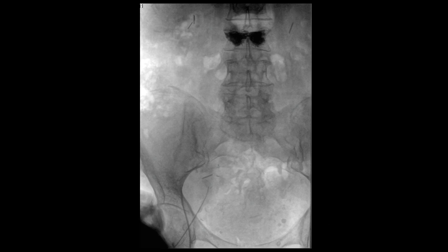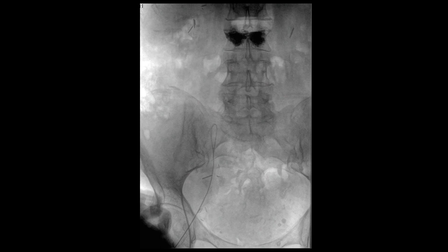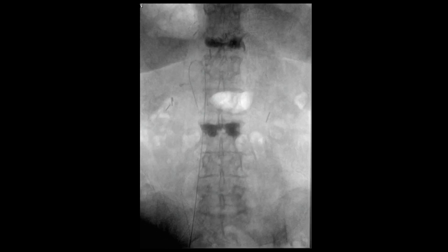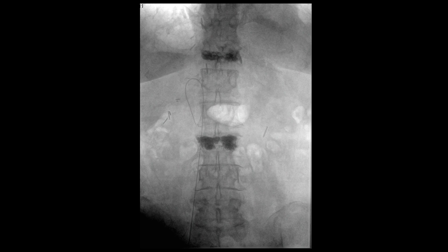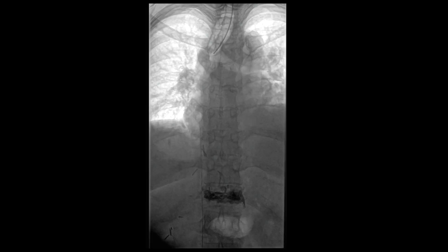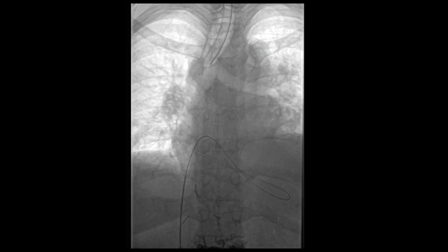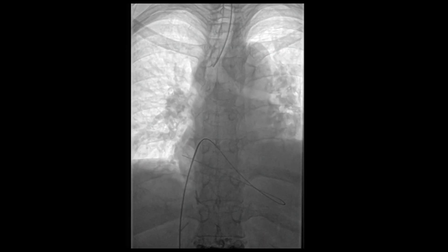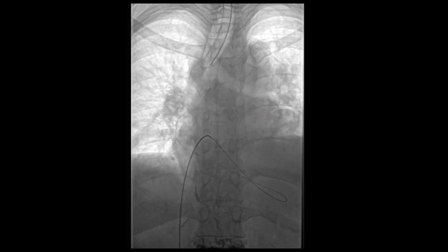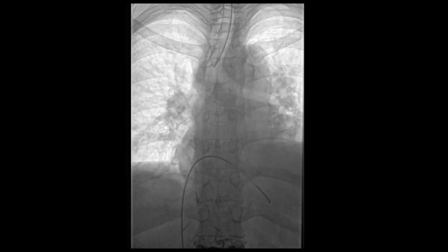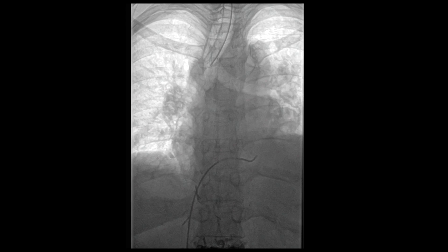Under ultrasound guidance the right common femoral vein was accessed with a mini-stick needle, followed by the wire and micropuncture sheath. We then introduced a Benson wire into the inferior vena cava, followed by advancement of this wire into the main pulmonary artery. This was done with the help of a guiding catheter such as a Berenstein catheter.